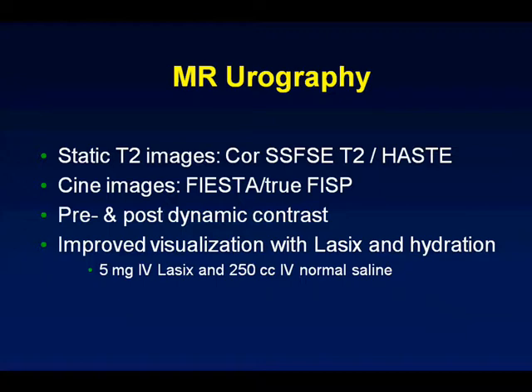And you can also give contrast to look for filling defects. To improve the technique, improve visualization, you really need to distend the collecting system, and we give Lasix and hydration, similar to what we do for CT-IVPs.